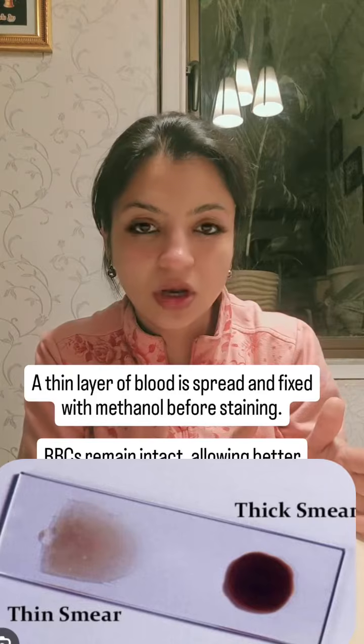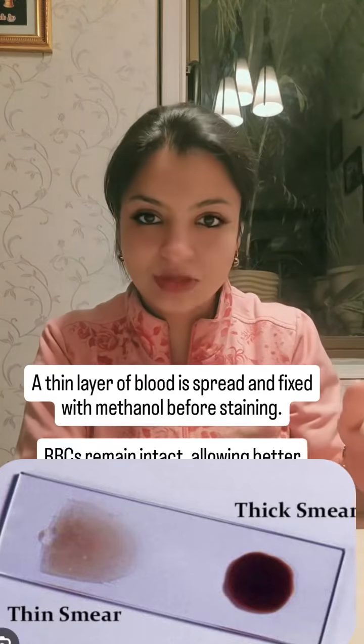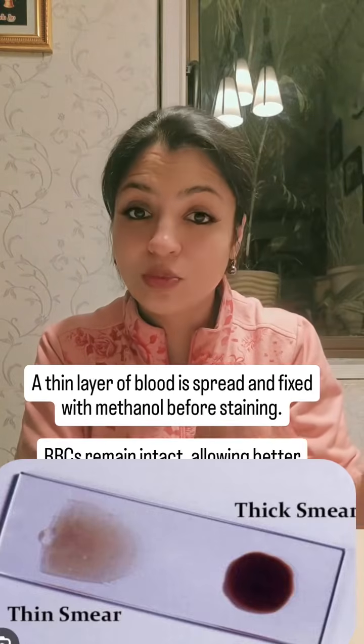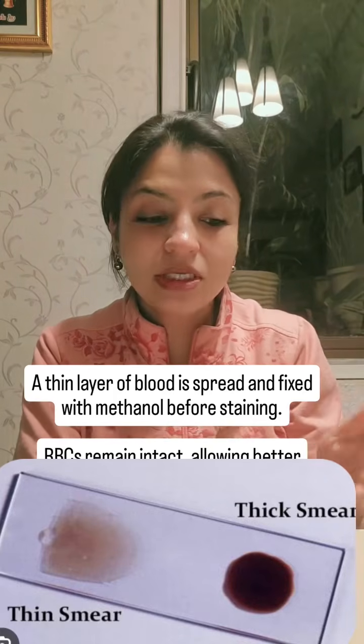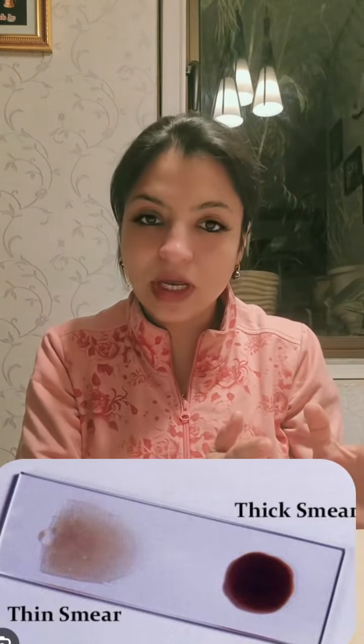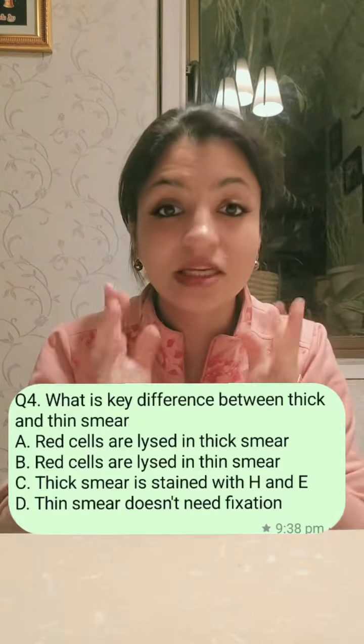Whereas, what do you do in a thin smear? In a thin smear, you make a slide, you fix it in methanol, and then you put Giemsa stain on it, and then you stain it at pH of 7.2. The point is, because you've fixed it, the red cells will not get lysed. So you will be able to identify the parasites inside the RBCs, and you can identify the species and the morphology of the malarial parasite well.